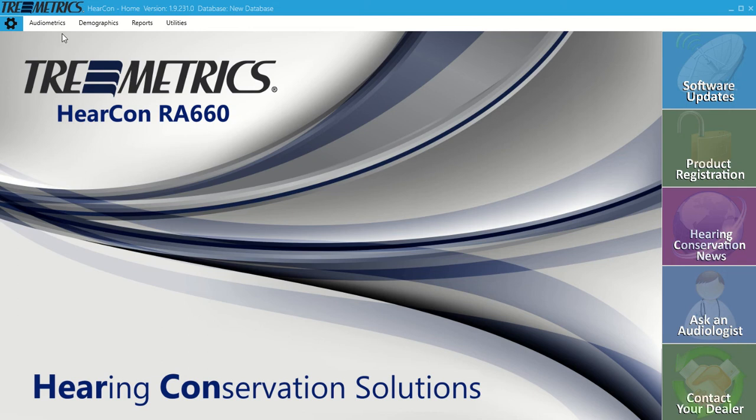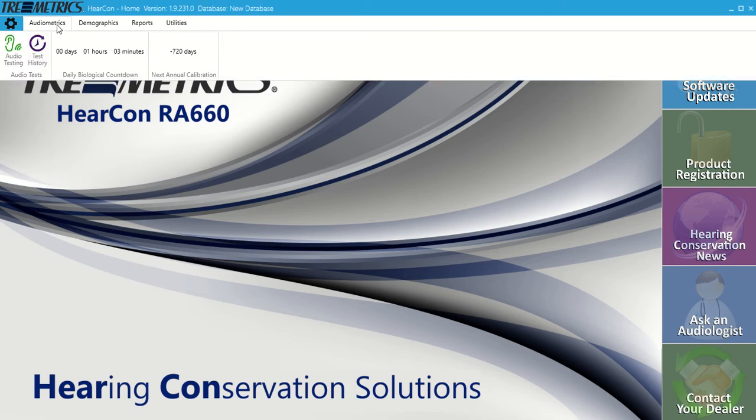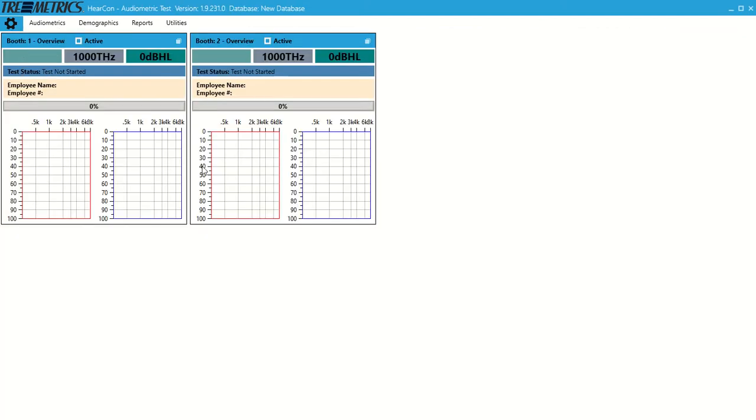If we go up to Audiometrics, Audio Testing, right now we have two audiometers plugged in. If you had eight, you'd have eight separate tiles here, so every audiometer populates as a tile.